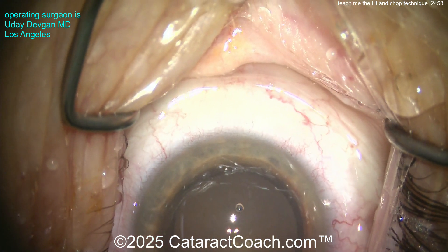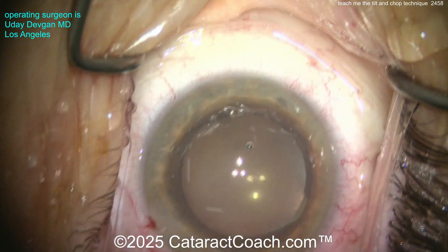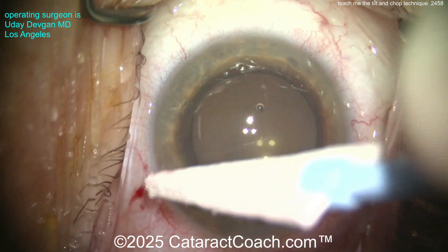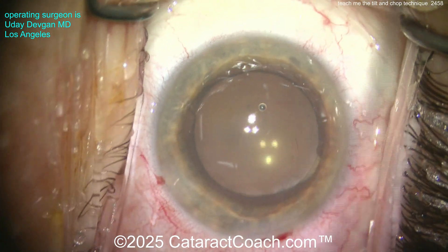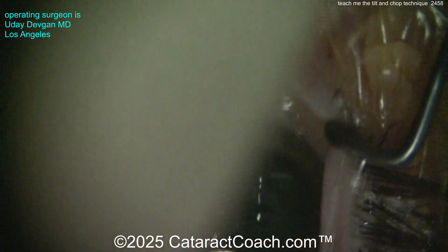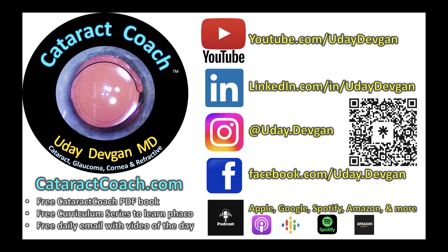Now let's check the incisions. Hey Cataract Coach, can you center up the camera? There you go. Everything looks good — incision is nice and watertight, and we are done. Try it yourself — tilt and chop technique. I promise you're going to love it. Remember that podcast too: the top podcast in all of ophthalmology, everywhere you find podcast services. It's just an hour a week.